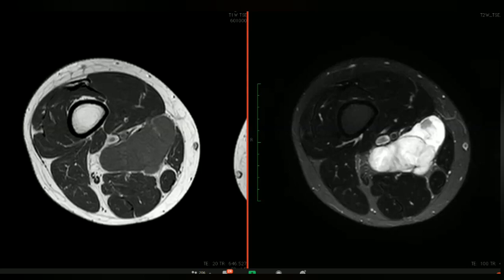Okay. All right. I don't agree with it. I categorically disagree with it. So you are basically saying, the answer that you gave, the reason for giving contrast was that it's going to help you differentiate between benign and malignant lesions. Okay. That's one, and I'll come to that. Secondly, second question to you. What's the next step in management for this patient?